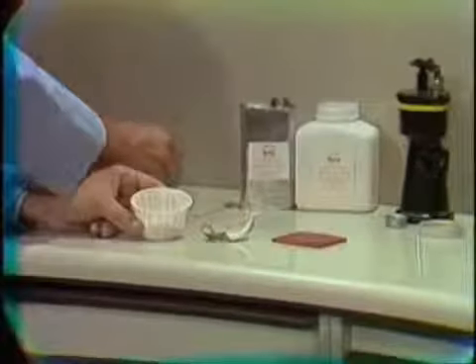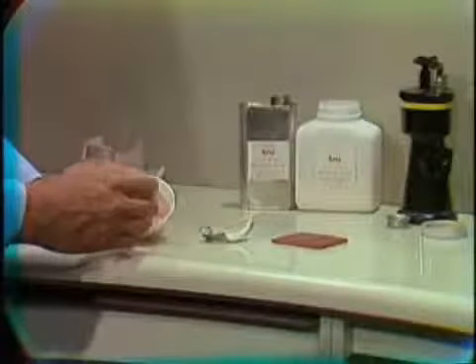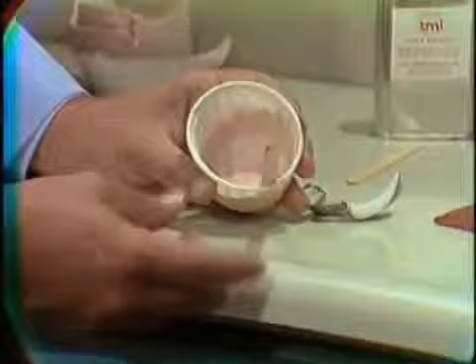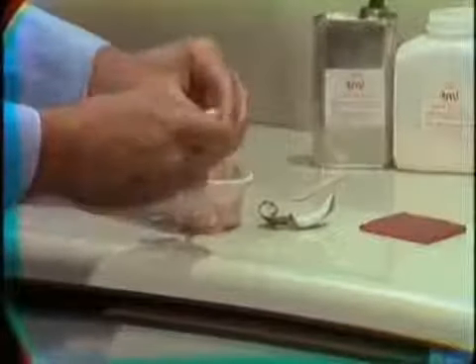So we're going to mix some of this acrylic. We're merely going to add the liquid, as with other auto-polymerizing acrylics, and mix it together, and it'll take just a few minutes probably to reach its working consistency. The acrylic is now reaching its working consistency, and I have my hands Vaselined, and hopefully the material will not stick to my fingers.